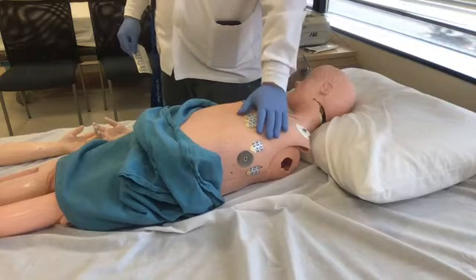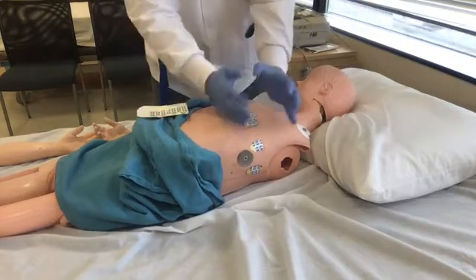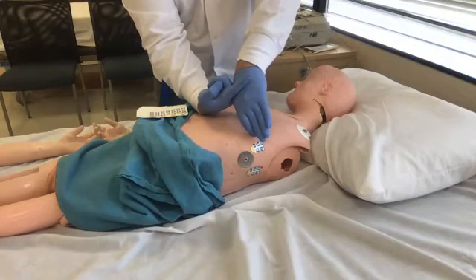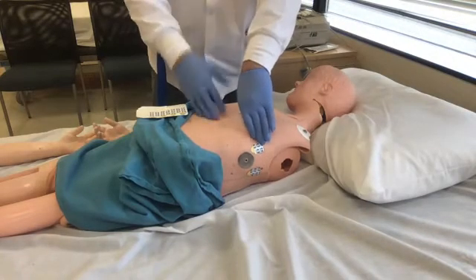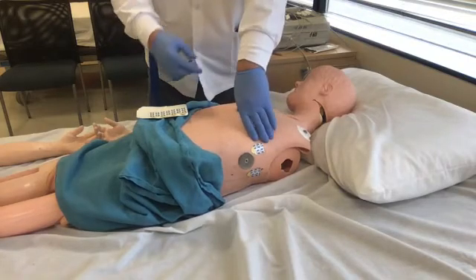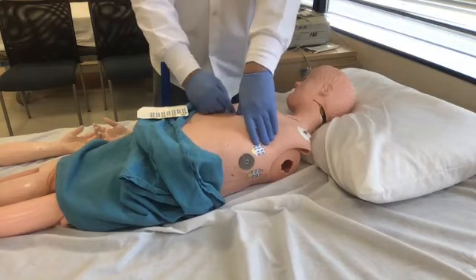But again, like I told you, sometimes if you have massive breast tissue here, like they've got D cups or something like that, sometimes the tech puts it down here. But if the tech puts it down here, where is it pointing? Pointing up. But like I told you, a lot of the modern EKG machines that are made in the last 10 years will compensate for it. Or when I plug it in, it'll go dee, dee, dee, and it'll tell you something's awry. And then you just move it. Another trick is you just move it until the beeping goes away.